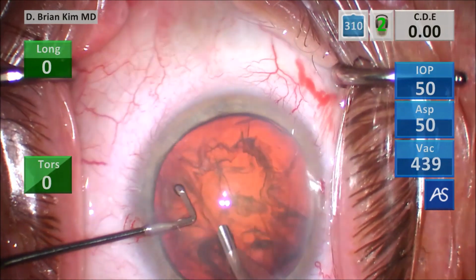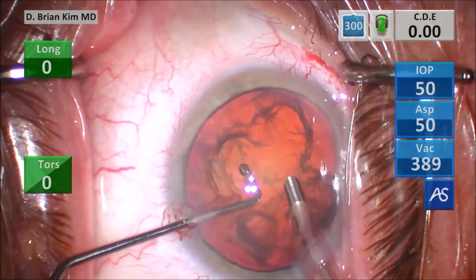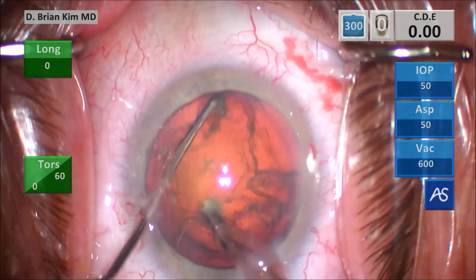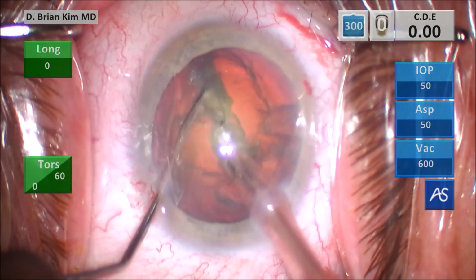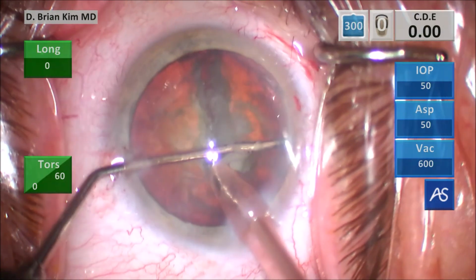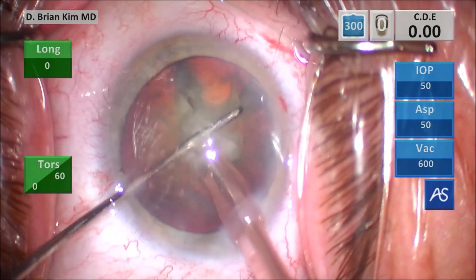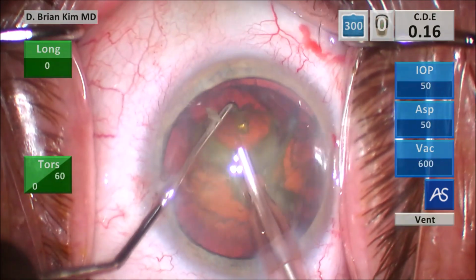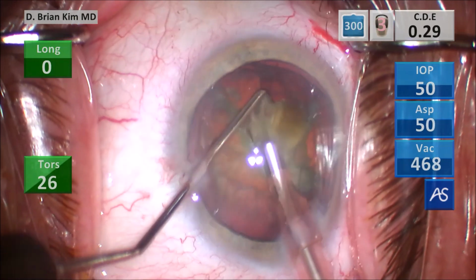And then I'm pronating my hand, sliding the leading edge of the chopper underneath the rexis edge, getting it to the equator, tilting the phaco tip vertically subincisionally, bringing the instruments together. You can see that compression force, that whitening of the leading edge of the lens piece, placing the chopper around the right heminucleus, pulling it centrally toward the phaco tip and fracturing that lens completely in half, lifting that first quadrant up with some vacuum and then crushing it into smaller pieces.